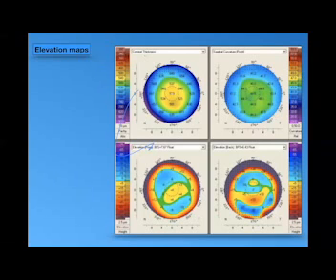Yeah, if we consider this patient as a steep normal cornea, I will go for a flap-related, flap-including procedure. I will ablate. You will be worried about buttonholing when doing the microkeratome.